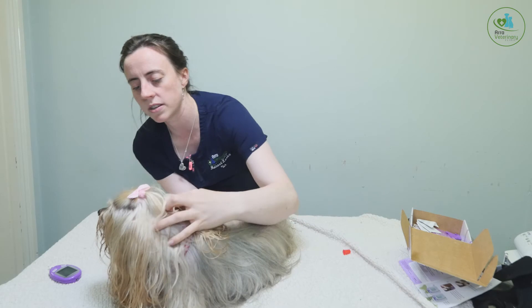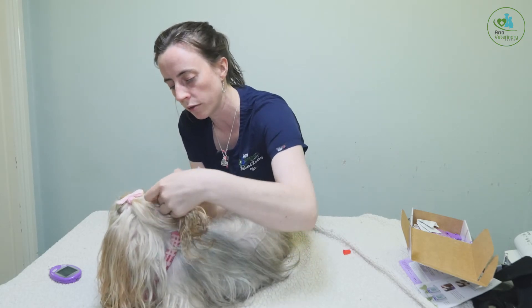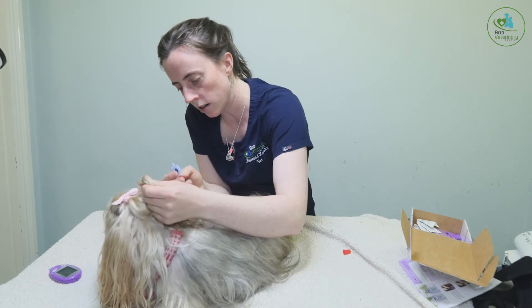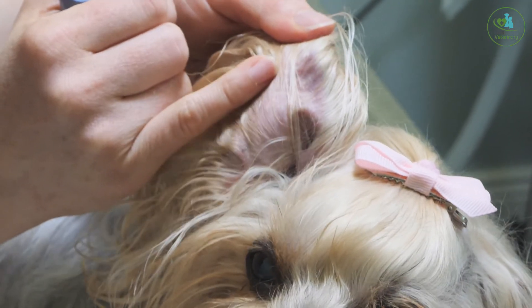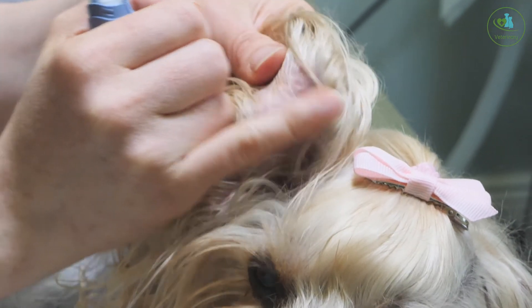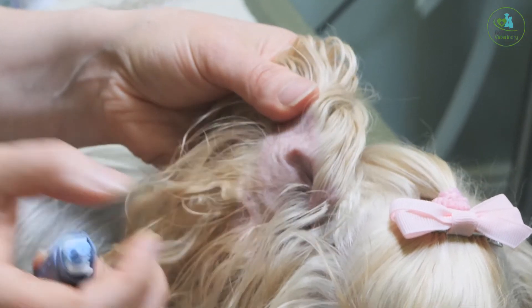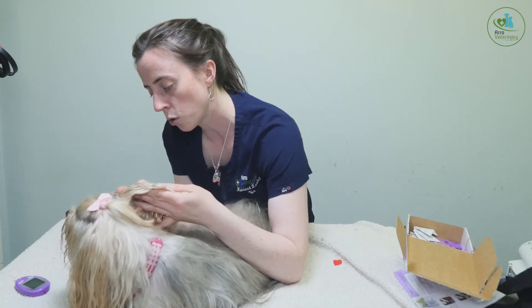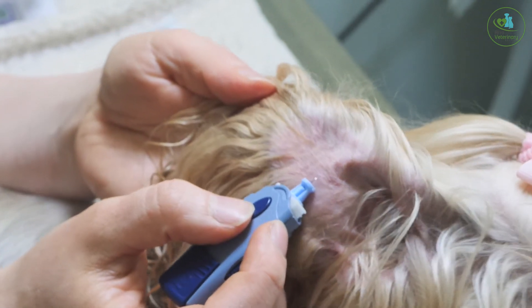The other spot to take a blood glucose from is the ear. There's a vein in the ear — if you hold the ear up gently and have a look, they have a vein running along the lateral side. You can see the little capillaries there. That's the area you take the sample from — hold your lancet up against it and get a tiny little blood sample out.